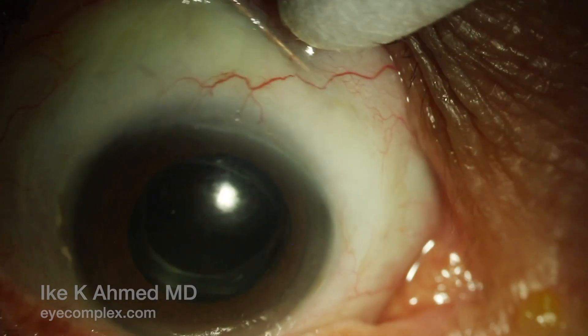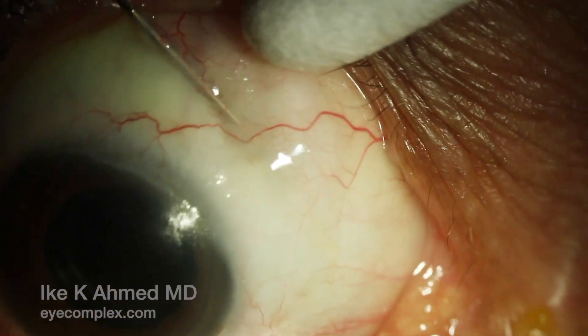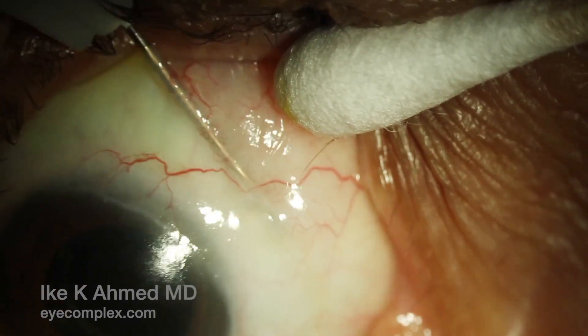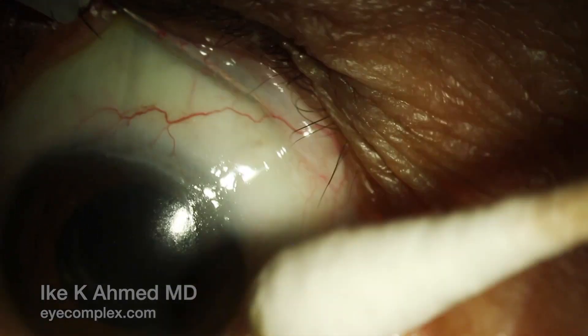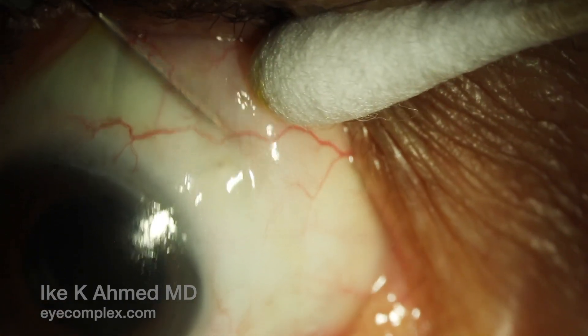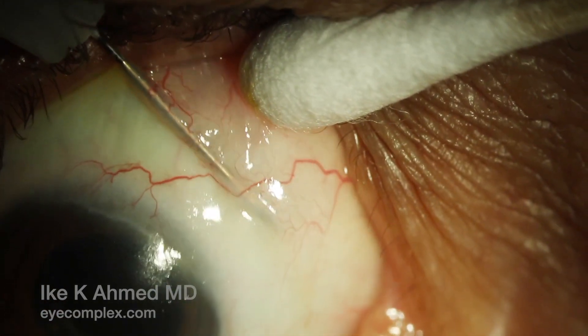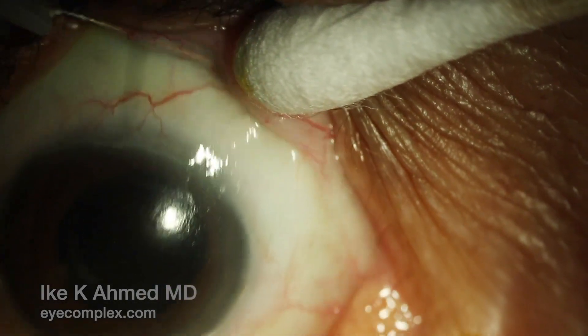The goal here is to ensure adequate flow emerging from the implant in the subconjunctival space. We already see some elevation of the conjunctiva with some fluid percolation now in the subconjunctival space, accompanied by a reduction in IOP immediately after the needling.